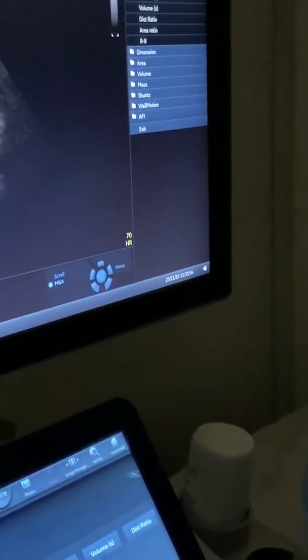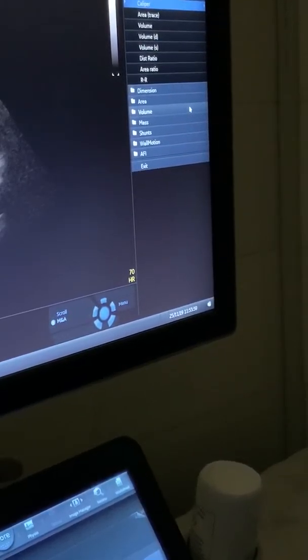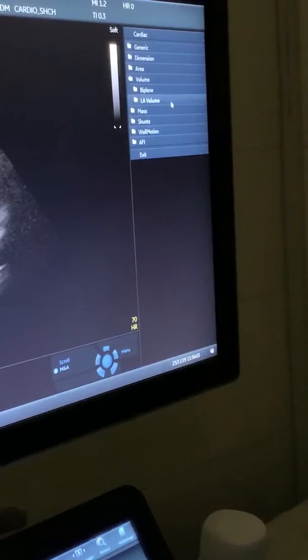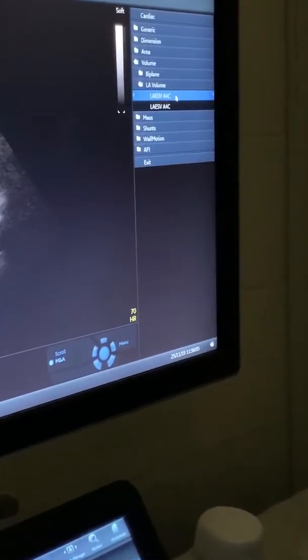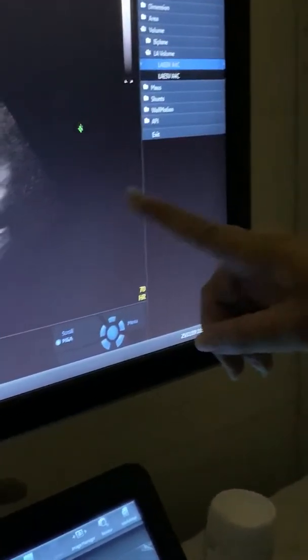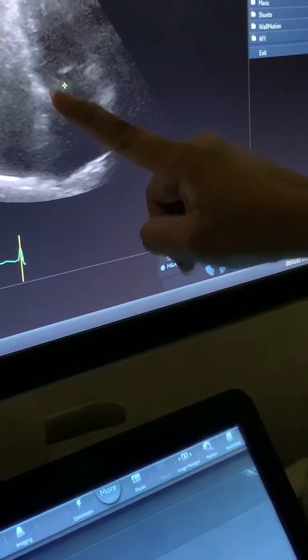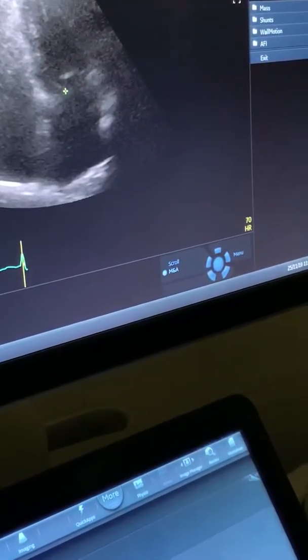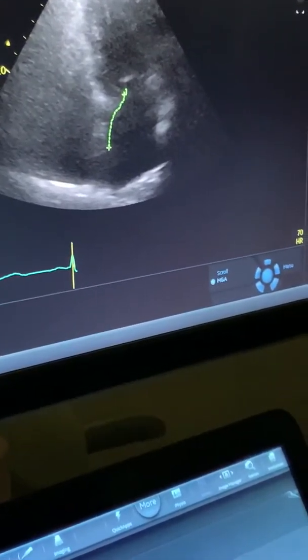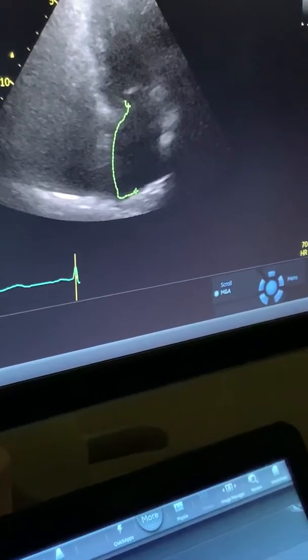Volume. You go here, not here. Yes, LA volume. Very good. Now you see it's end diastole and systole. You can start measuring now. I go to the side and then I trace it. Sorry, this one is not yet automatic. I don't have the artificial intelligence yet.